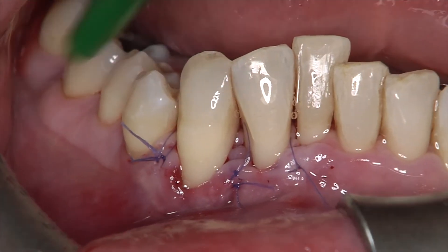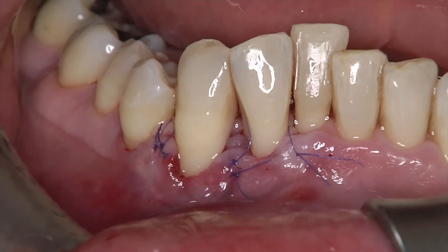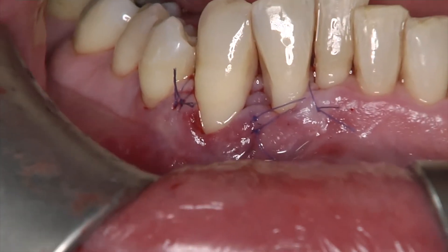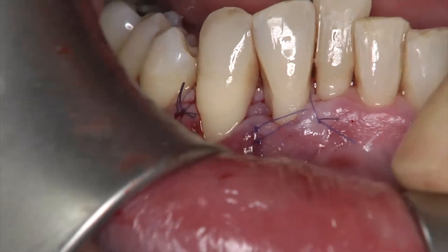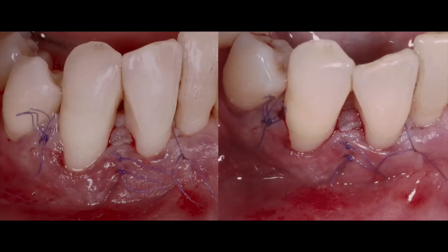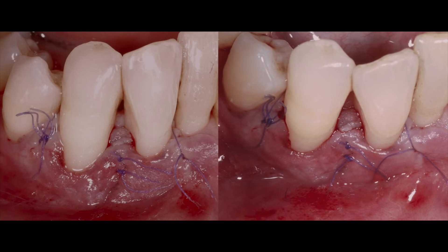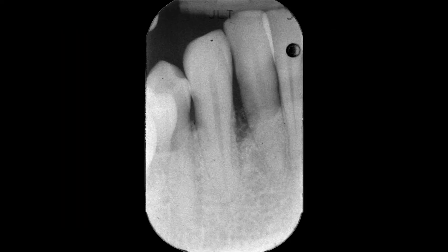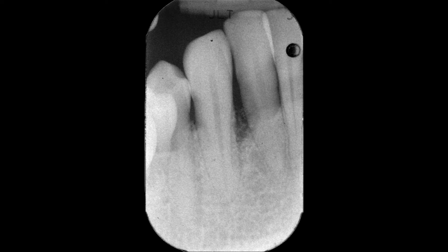Further interrupted or internal mattress sutures are used to close the adjacent areas of the defect. Sutures are left in place for 14 days. A chlorhexidine regimen is maintained for 4 weeks. Any trauma to the interproximal papilla by brushing should be avoided, and the patient has to be enrolled in a stringent maintenance regimen.